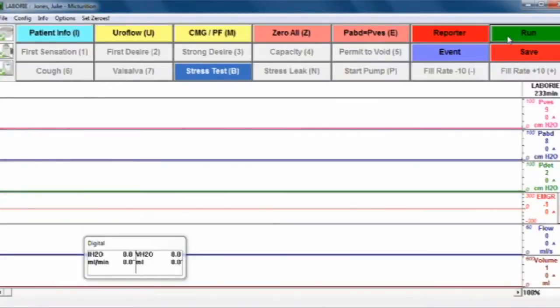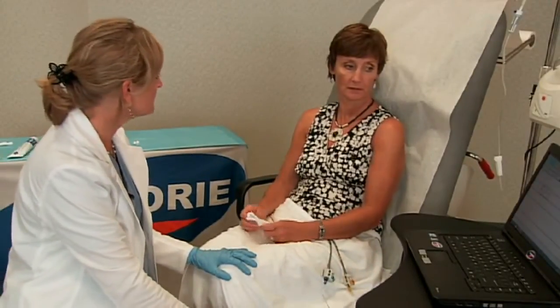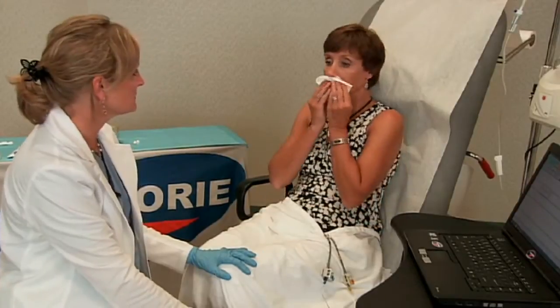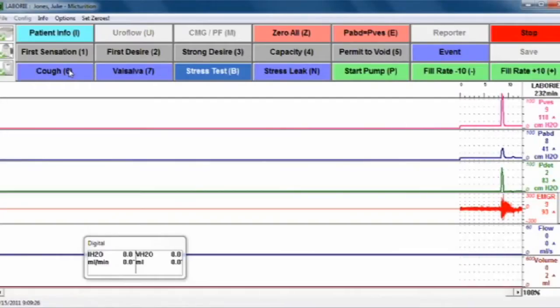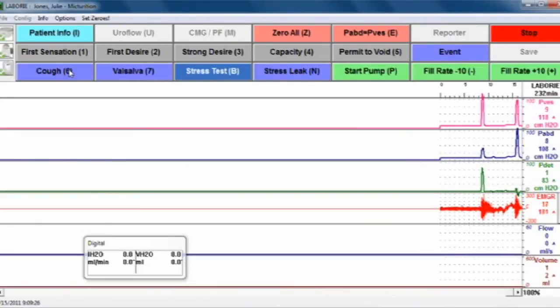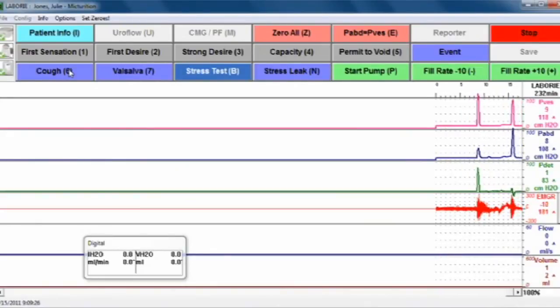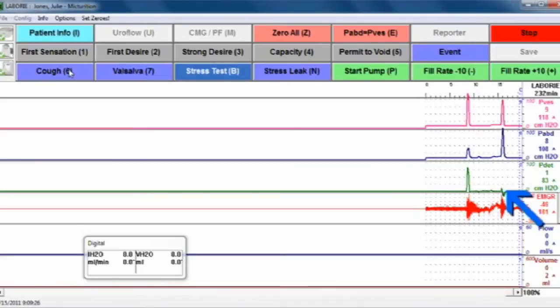You'll then hit run and ask the patient to cough. Both catheters should respond equally with the PDET channel remaining relatively flat, like this example here.